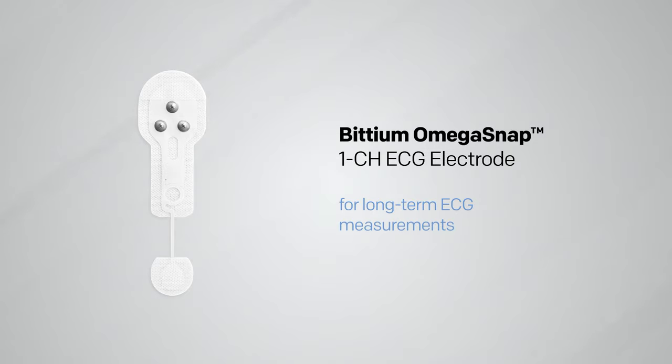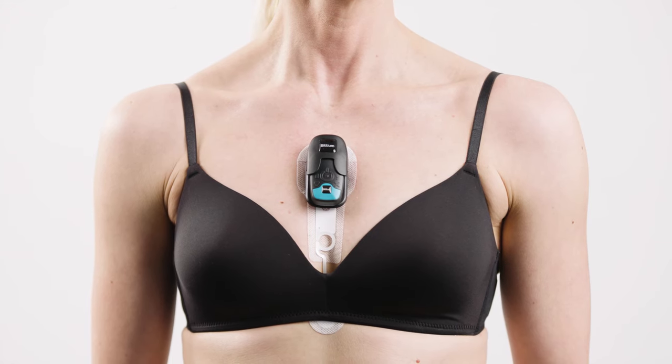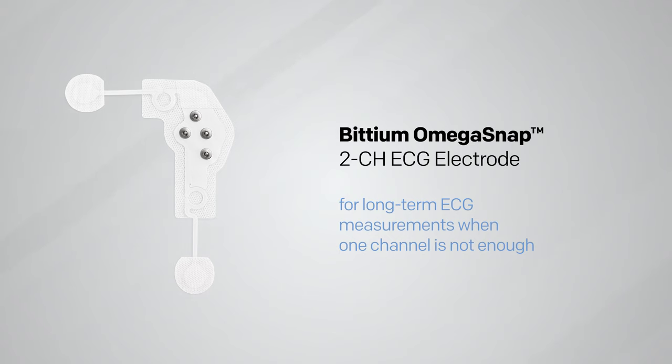How to select the optimal setup for your needs: the Bitium Omega Snap one-channel electrode is the most cost-effective and reliable patch electrode for long-term ECG measurements. It is also suitable for HRV applications and for heart monitoring for stroke patients. The Bitium Omega Snap two-channel electrode is the best choice when more than one channel measurement is needed while maximizing patient compliance.